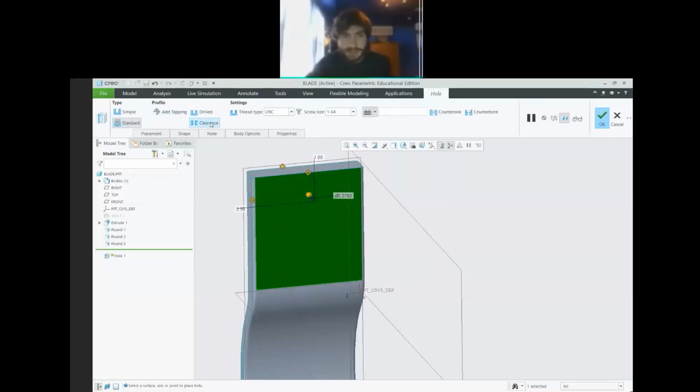And we're going to make it a clearance hole. So we'll unselect this add tapping and make it a clearance hole. So this thread type, how is the thread defined?